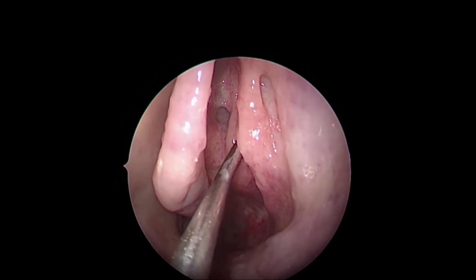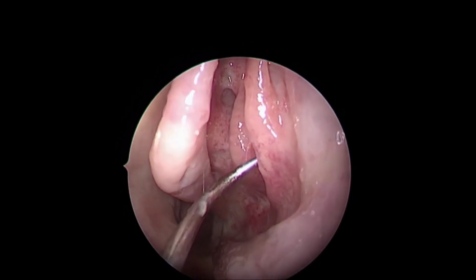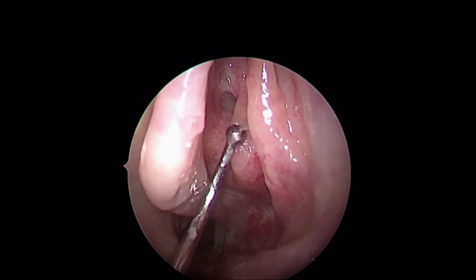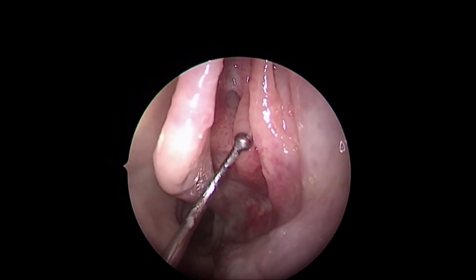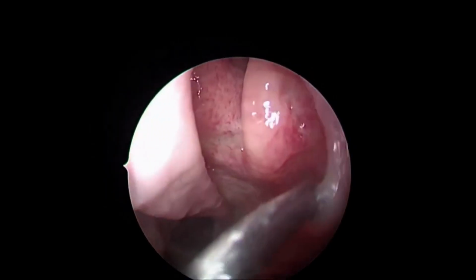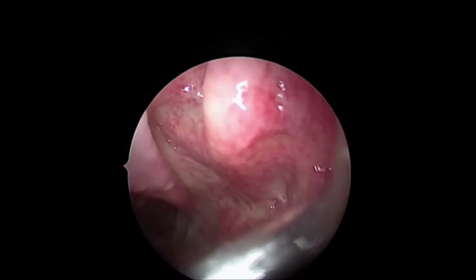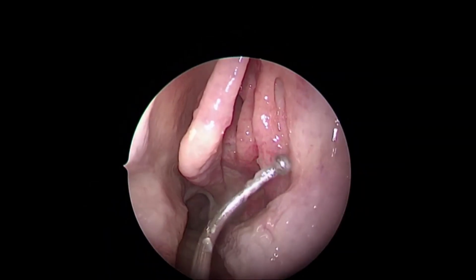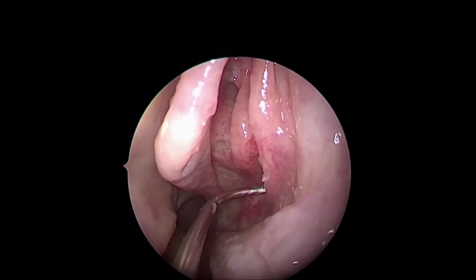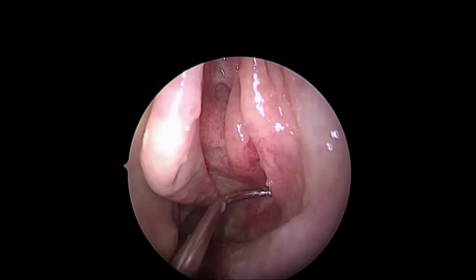This is known as the hiatus semilunaris inferioris. It is a semilunar-shaped hiatus between this prominence and the next prominence behind, that is the bulla ethmoidalis, the anterior ethmoidal cell. And we will see, once I remove the uncinate, how this hiatus leads laterally into a three-dimensional space known as the infundibulum. Once I open this space, this step is known as infundibulotomy, if I remove this uncinate to uncover the infundibulum, which is actually a three-dimensional space into which the maxillary sinus ostium opens.